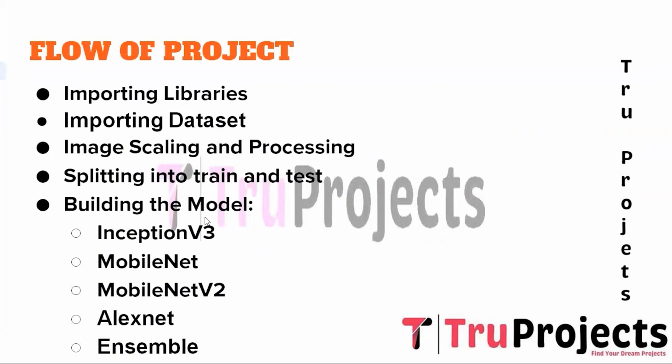The first one is Inception v3. It's a deep learning architecture known for its exceptional performance in image recognition tasks. It uses a combination of convolutional and pooling layers to capture the hierarchical features from the medical images of the knee joints affected by osteoarthritis. In this project, Inception v3 will be trained and evaluated to identify and classify the patterns indicative of knee osteoarthritis, contributing to the overall accuracy of the knee osteoarthritis detection system.